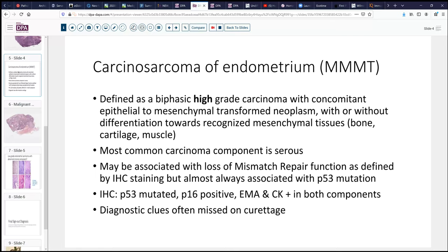Both components may also express epithelial markers either in the form of EMA or pancytokeratin. Sometimes superficial biopsies can either miss the sarcomatoid component or the diagnostic clues may be missed.